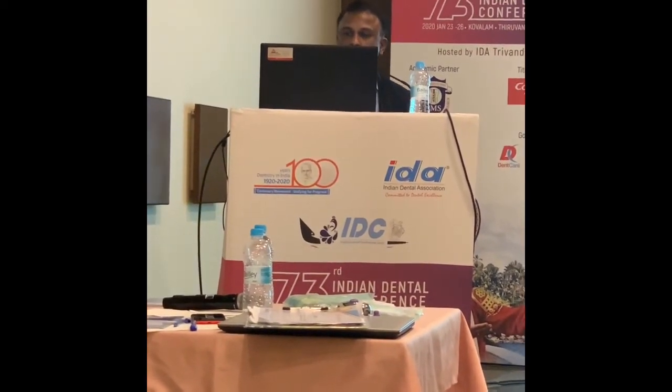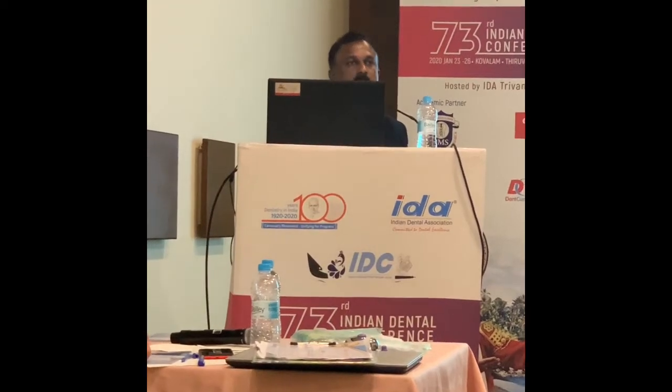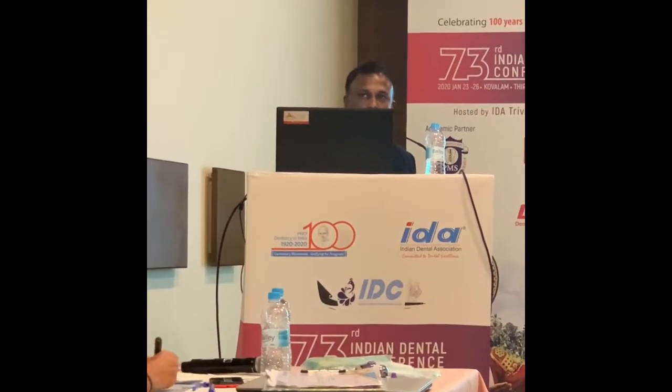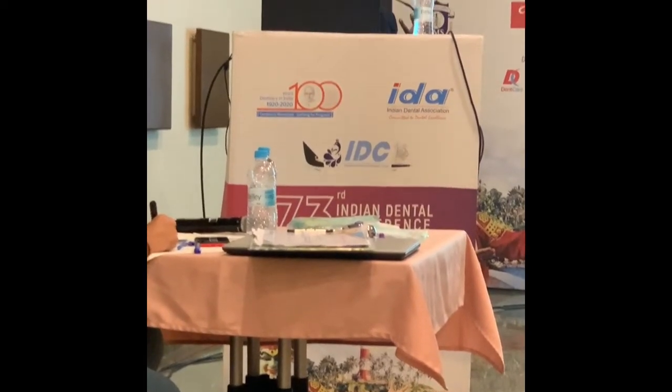So for the mandibular anterior region, as I said, the ridge is going to be narrow. So you go for implants called narrow platforms. I'm talking about the conventional implants, not the basal implants. So narrow platform implants means you can say it's about 2.65 mm or about 3 mm in width, and the length can go about 10 mm. Don't think there is no other vital structure in the mandibular anterior region and try to put a 16 mm implant, even if the ridge is small, you will definitely end up perforating on the lingual side, nicking the lingual artery.